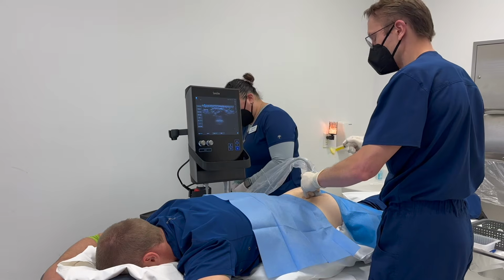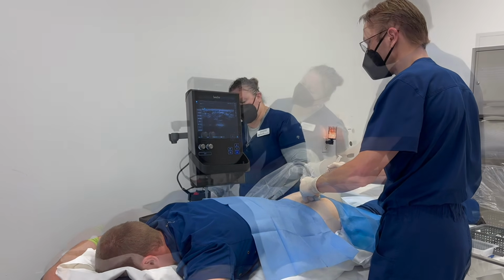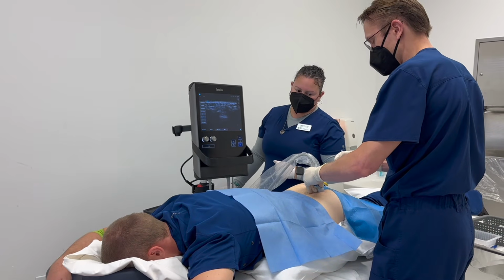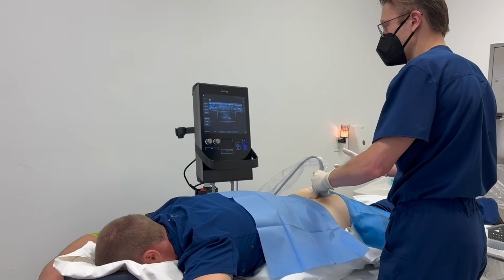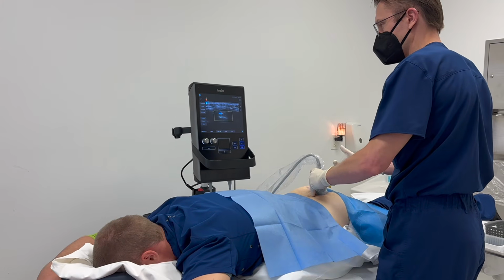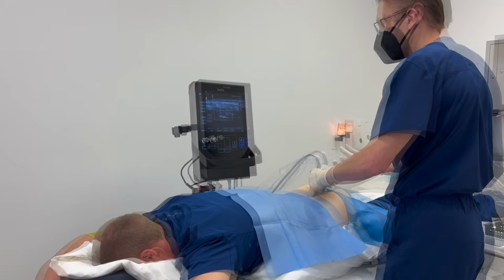So I'm going to go ahead and insert the needle to start the epidural injection. You can see the needle right in the midline. Go ahead and make sure we withdraw, there's no blood. Go ahead and put on a Doppler. So the needle is in the little opening in the tailbone, and I'm injecting the platelet lysate right now, and you can actually see the flow on the color Doppler.